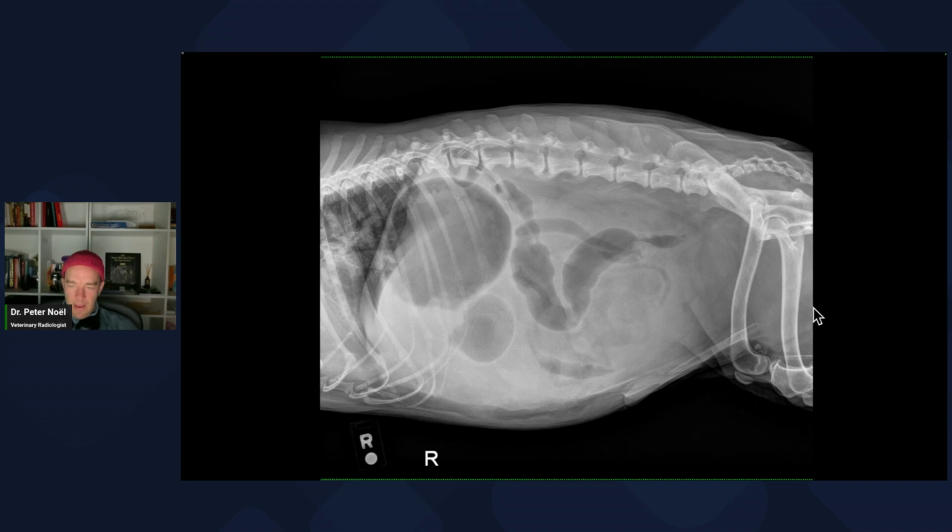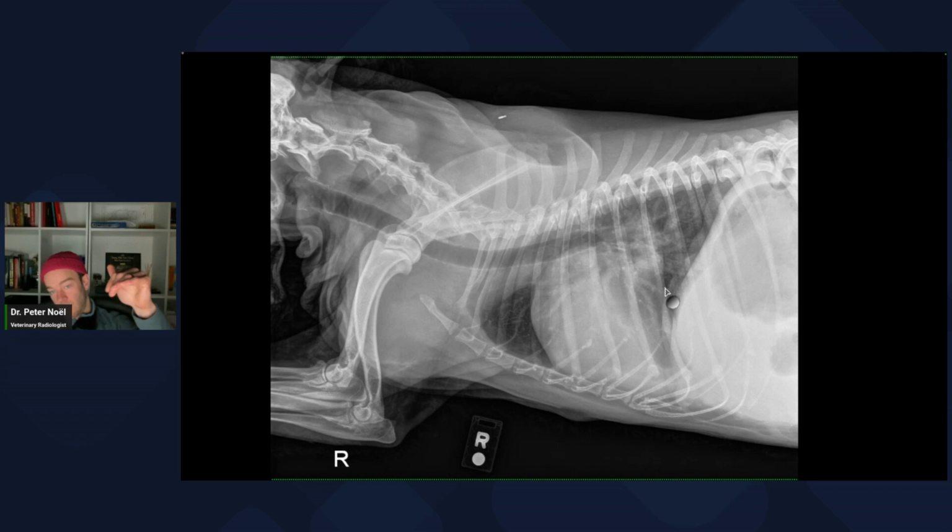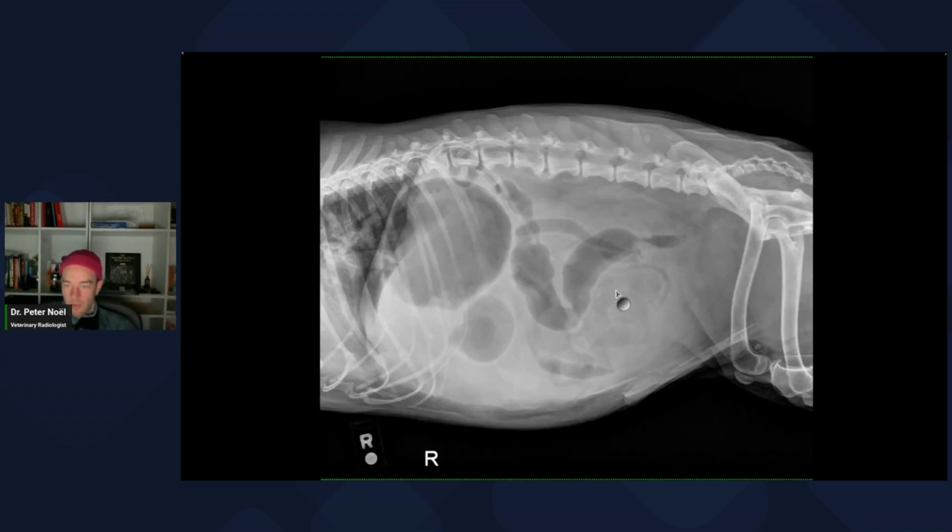So I think the dog has moderate left-sided cardiomegaly, maybe a little bit of right-sided component, but that could be from chronic left-sided disease. I wonder about low-grade left-sided heart failure to cause edema in that right caudal lung lobe. So you do a DV radiograph, but it's not definitive by any means. But with the presence of cardiac disease and peritoneal effusion, you should at least wonder, does the dog have right-sided heart failure?